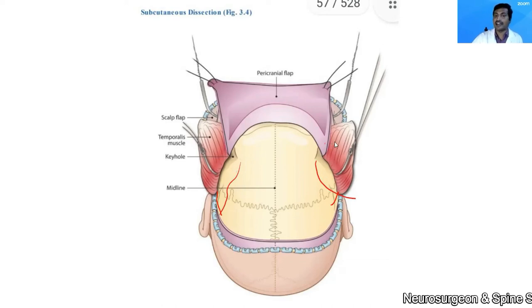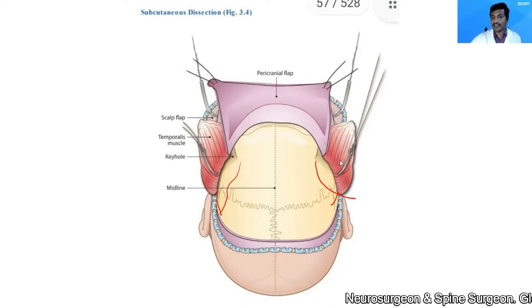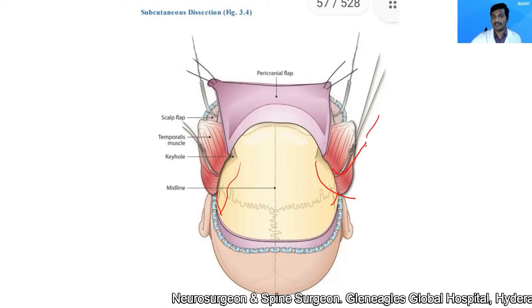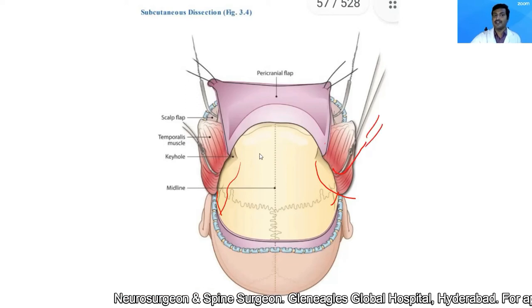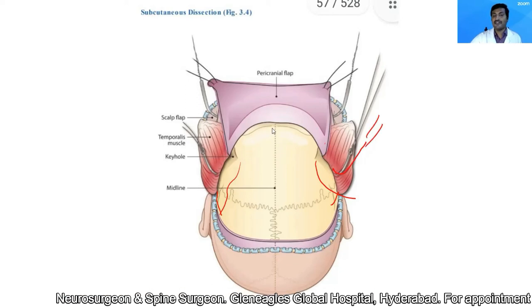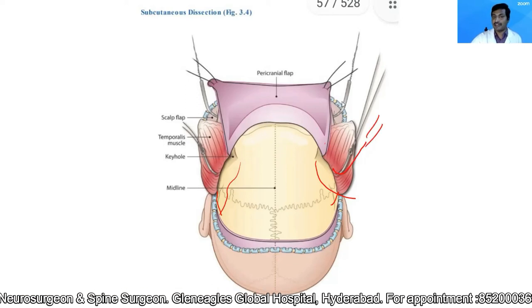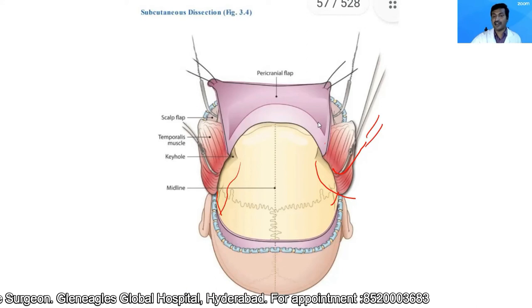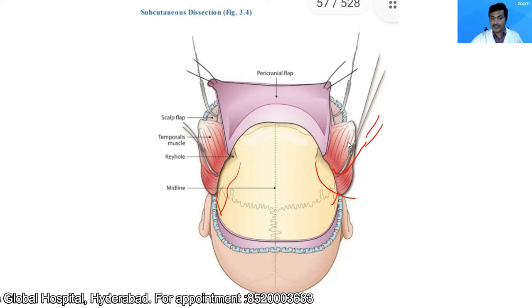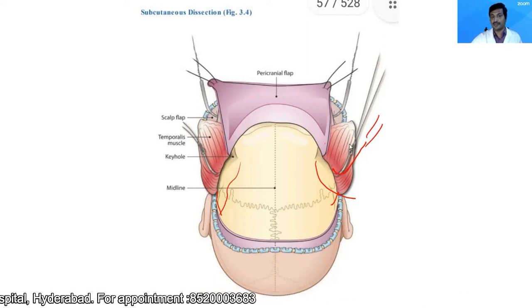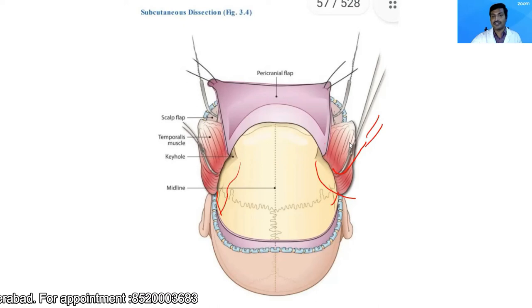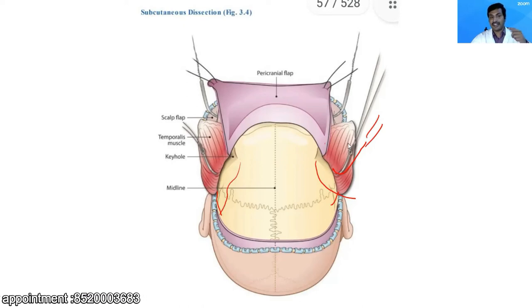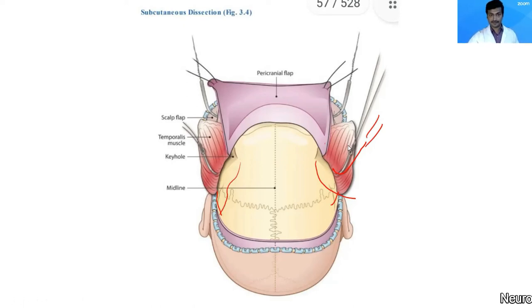I then reflect the temporalis muscle anteriorly and hold it with fish hooks. Whenever I reflect a flap — whether the skin flap, pericranial flap, or temporalis flap — I use gauze rolls so that the reflection does not compromise the blood supply.